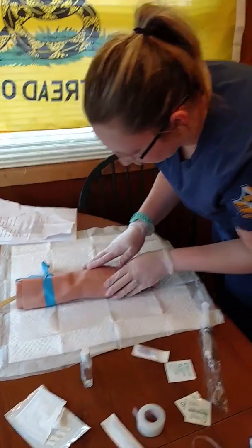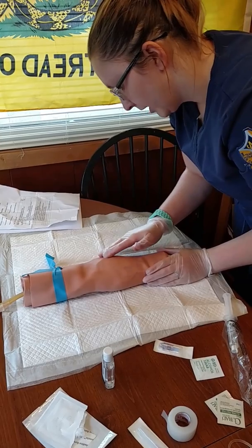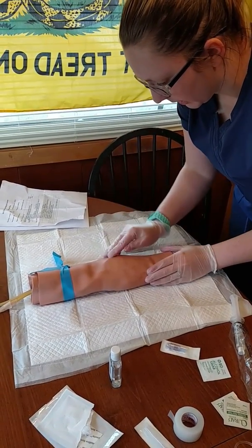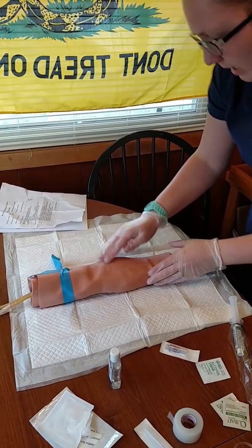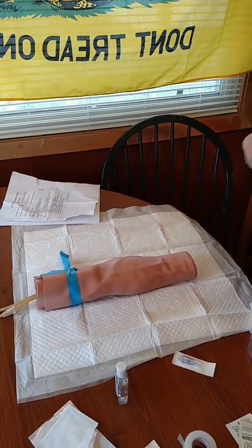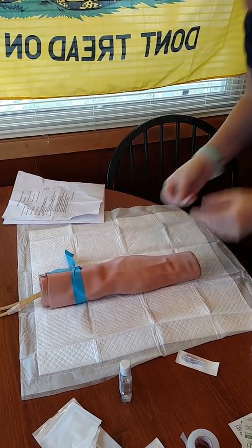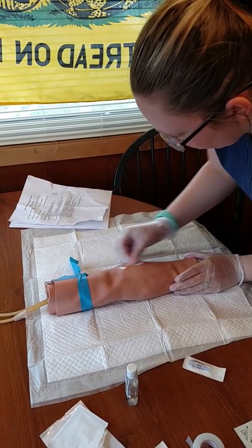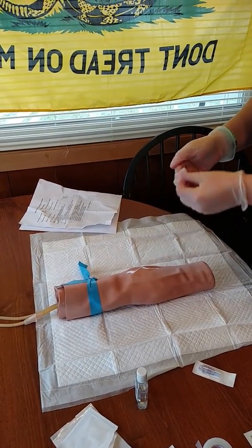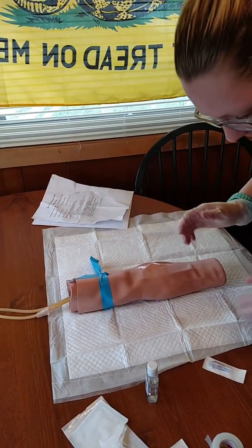Just gonna feel around and see if I can find a good vein here. We don't want to go in the antecubital if we can help it because it's a sore area as we bend that a lot. So I think I found my vein here. Wash with alcohol, trying to get that blood flowing, and then I'm also going to wash the tips of my fingers since I've touched without that.